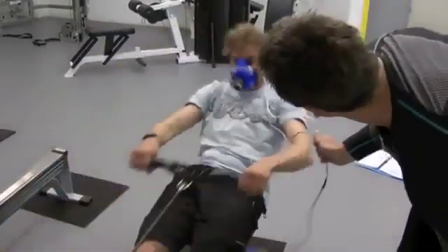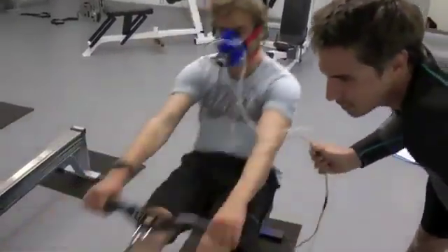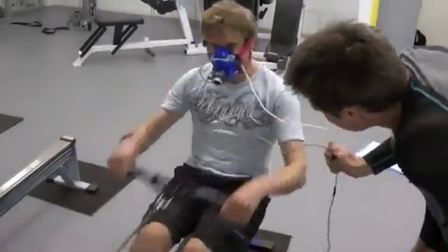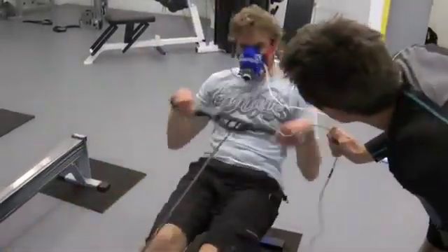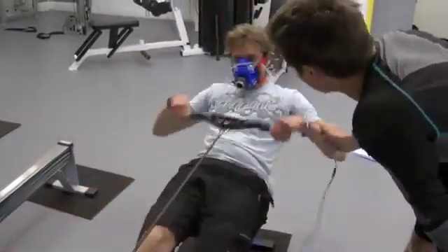Keep it going. Last 10 seconds — absolutely push it. Come on, Simon, push it out. 10 seconds. Really hard, really hard, keep it going. Harder, harder. Come on now — harder than that. Keep it going. Well done.